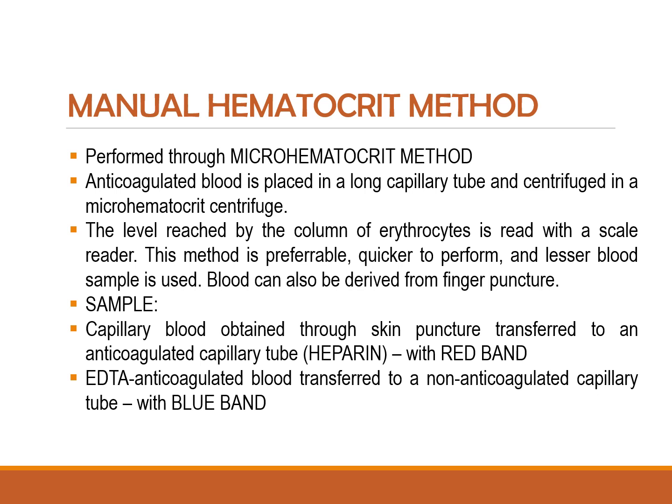This method is more preferable than the macrohematocrit method because of the following reasons. Number one, it's quicker to perform. Number two, lesser blood samples are required from the patient. And number three, there is lesser centrifugation time. Blood can also be derived directly from the skin puncture of a patient.